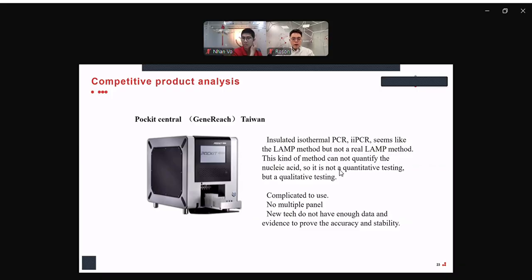In my personal perspective, the single tests are normally used to verify the clinical doctor's thoughts, to verify their judgment of the disease, but cannot be used to screen the disease, especially for diseases with similar symptoms. Just like we have the respiratory 5-in-1 panel, because these five pathogens cause similar clinical symptoms.